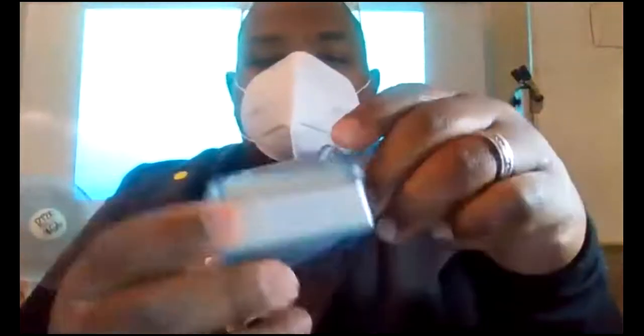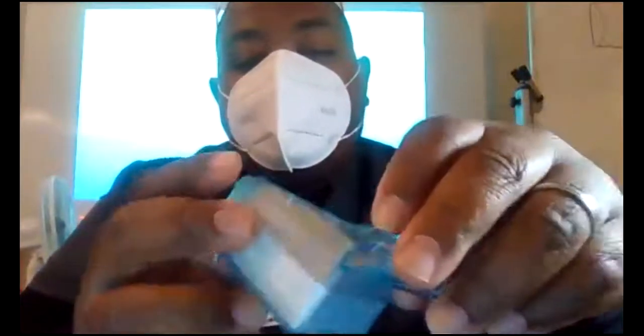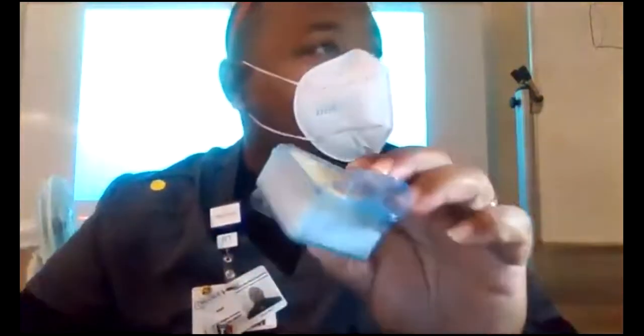It's like CO2, not trapped in there. It's the same CO2. So which end goes to you? You would have this end going to your device and have your tubing coming here, because this is going to be close to you. And when you blow out, you're blowing out through here. But you won't have to know what end is which. You just need to know what it is and what it does.